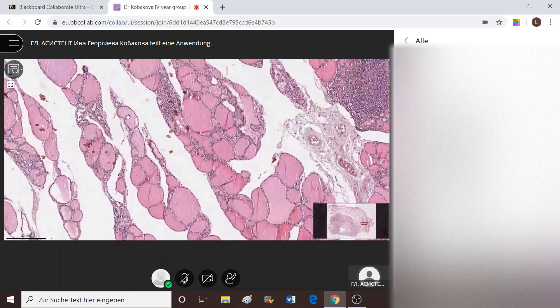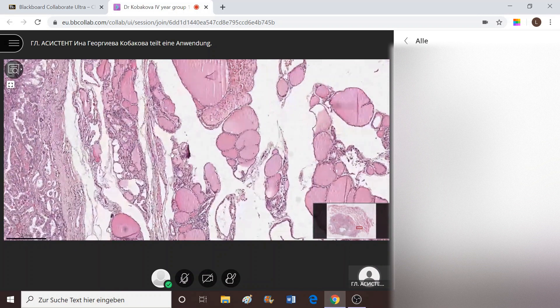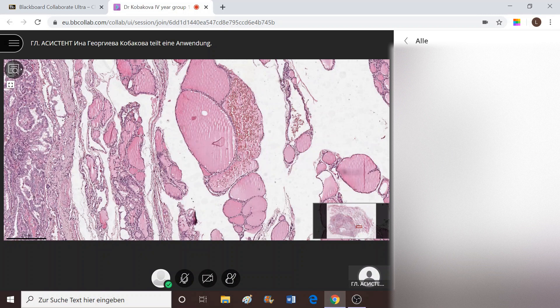Further, we again see cystically dilated follicles. When there is such a process pushing the cuboidal cells to flatten out, how do we call this adaptation process? Do you remember from general pathology? It's known as histological accommodation. That is what we should mention when the professor asks what this type of change means.